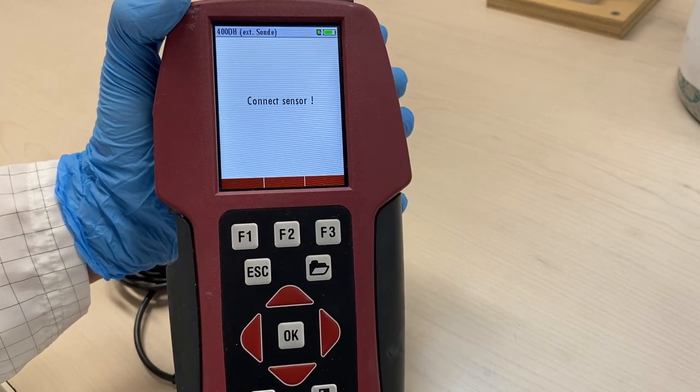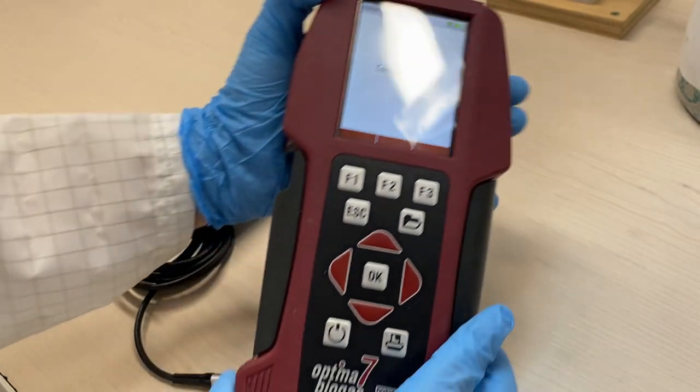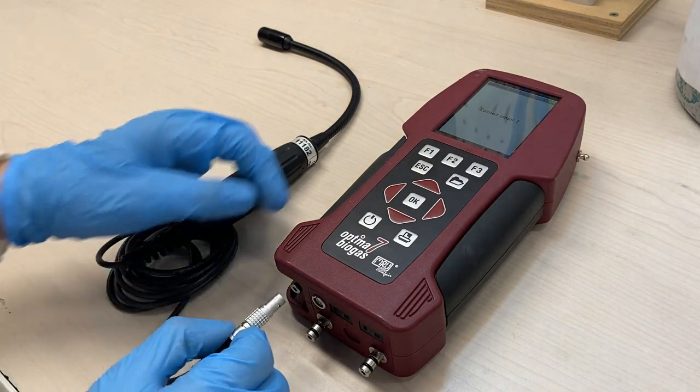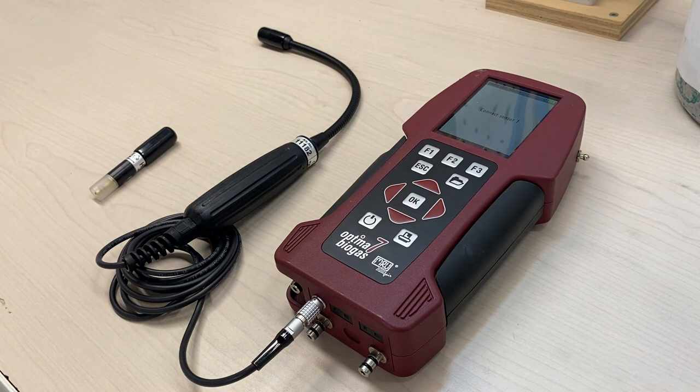The window will display the alert Connect Sensor. Attach the sensor probe to the auxiliary port, making sure the red dot on the probe aligns with the red dot on the auxiliary port.